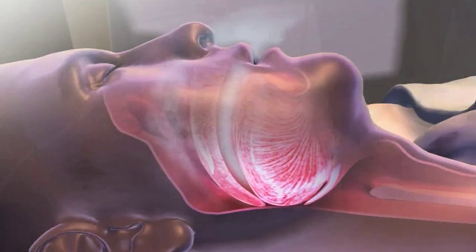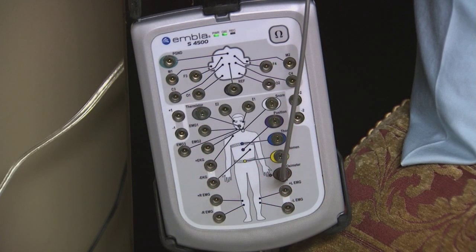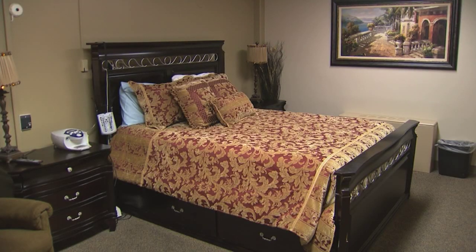Patients are diagnosed by spending a night hooked up to monitors in a sleep lab. In the coming years, before you can do a full sleep apnea study, you have to do a home study first. And there's not really a good product available for that market right now. But what's interesting is sleep apnea. The problems that are caused by sleep apnea are kind of a gateway to cardiovascular disease.